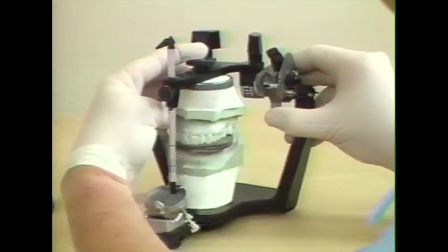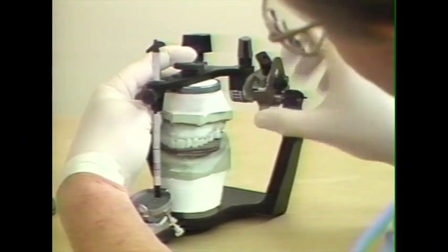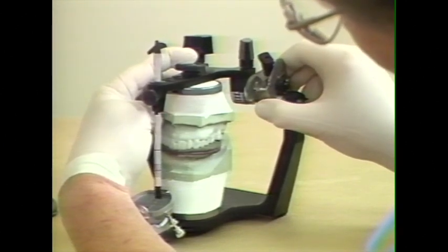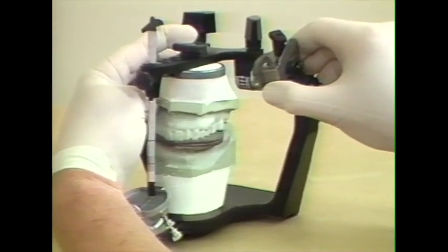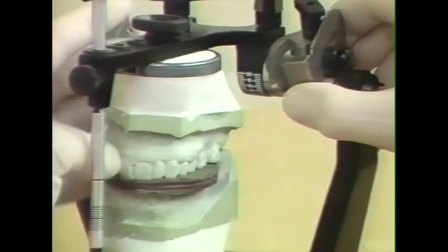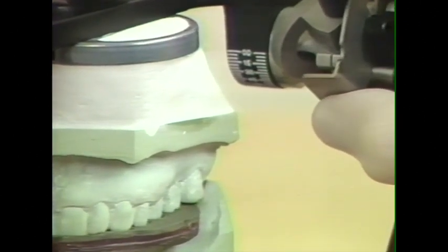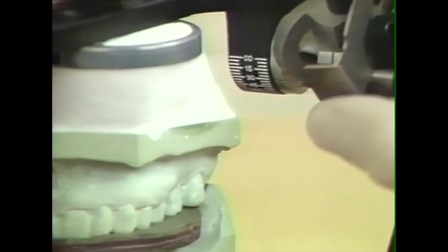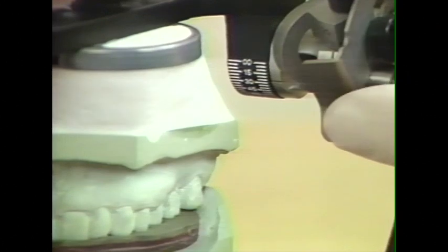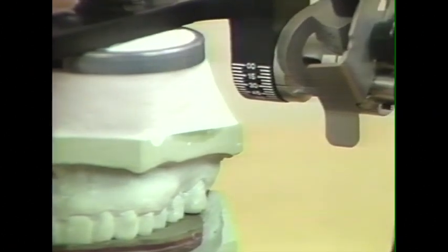We press down firmly and we move the condylar inclination so that it's too low, and the anterior has come up. We move it down until it's too high. And the posterior comes up off of the record, and we even out the record, and our condylar inclination is approximately 27 degrees. We can lock that in position.